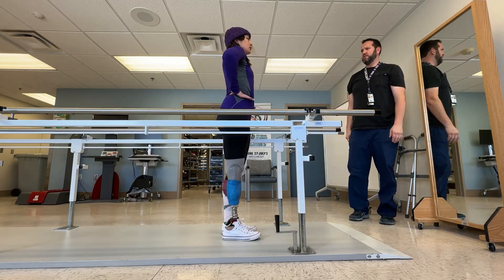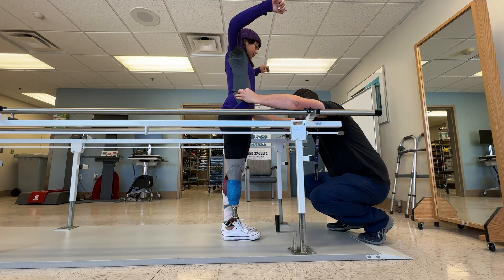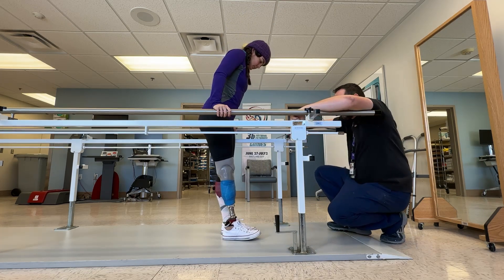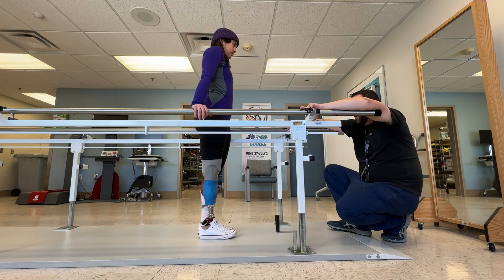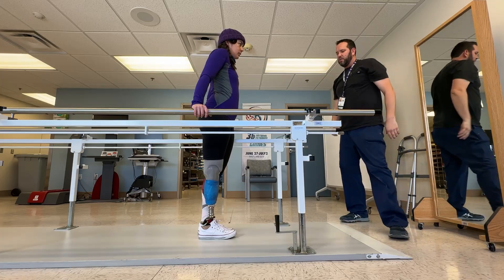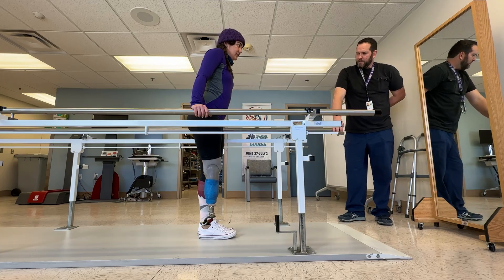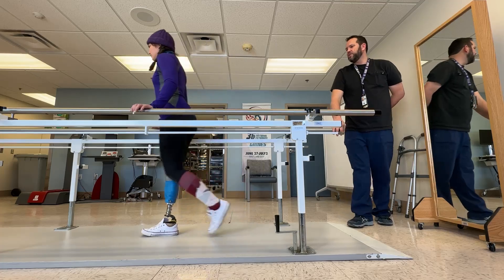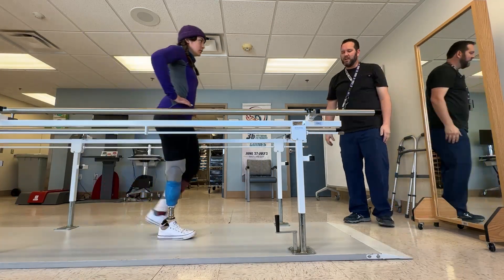How do you feel height-wise? I'm feeling good. Yeah? You feel pretty good about it there? Yeah, and your height's looking good. That alignment is funky. Part of that's that we wrapped it probably too thick because we're like, you're not going to break it this time. Because I don't really like how you're walking with it either. And if that's where you're throwing it — that's because I feel it on my calf. My calf's just too big. Well, it's not that. You also have a narrow gait, which is actually considered efficient — you get more efficiency with a narrow gait. A big wide gait, you're actually pretty inefficient.